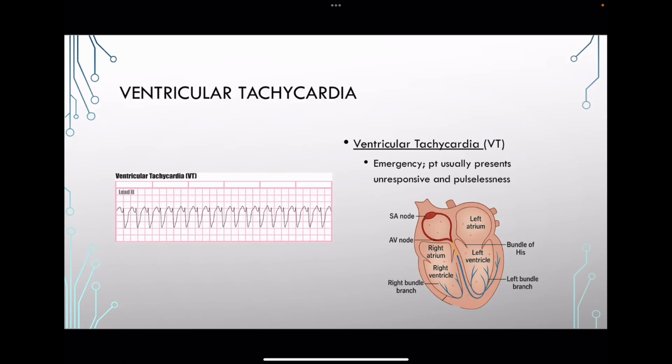All right, so with ventricular tachycardia, it's essentially the same thing as a PVC, but a bunch of them back to back. So essentially what's happening is there is a foci point within your ventricles that is irritated, and so it's continuously sending that signal not in its normal pattern and creating that wide complex because it's not dispersing it how it's supposed to be dispersing it throughout the entire ventricle. It's getting caught on that foci point and sending its electrical signal out too soon.